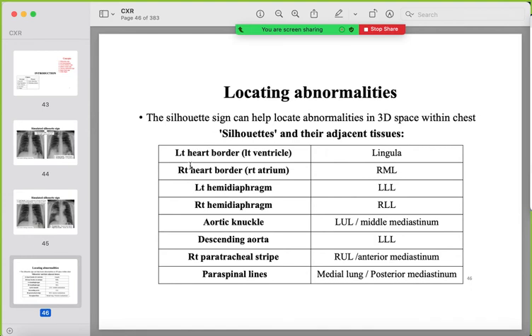Using the silhouette sign to localize abnormalities: if the left heart border is lost, there is abnormality in the lingula. Right heart border loss indicates right middle lobe pathology. Left hemidiaphragm obscuration indicates left lower lobe pathology; right hemidiaphragm indicates right lower lobe. The aortic knuckle is in contact with the left upper lobe or middle mediastinum. Descending aorta with the left lower lobe or posterior mediastinum. Right paratracheal stripe with the right upper lobe or anterior mediastinum. Paraspinal lines relate to the posterior mediastinum or medial lung.